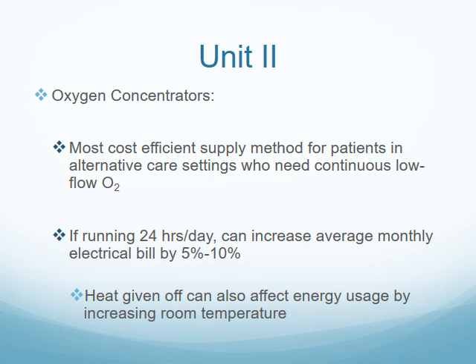If you have a chance and you think about it when you're in class, we have concentrators in our stock room. If you want us to pull one out and show you, I can gladly show you one. And I also have a video on the usage of the oxygen concentrator as well.